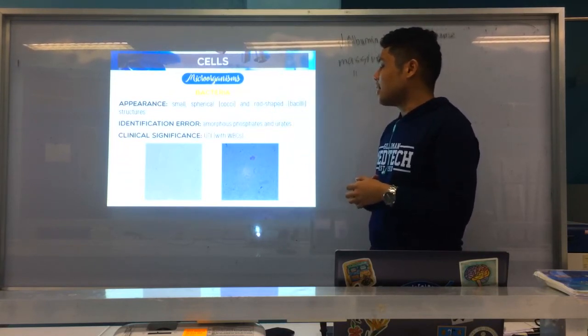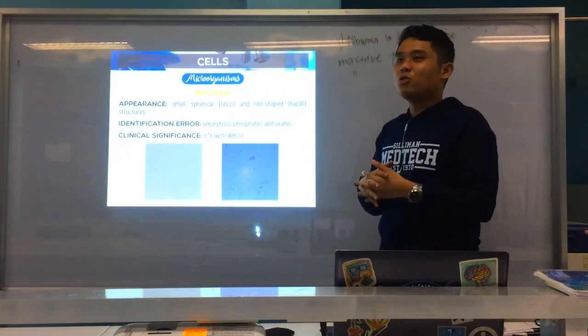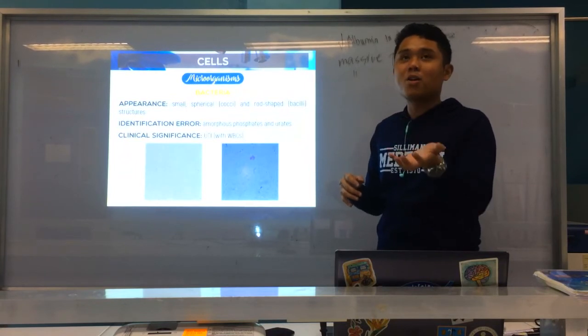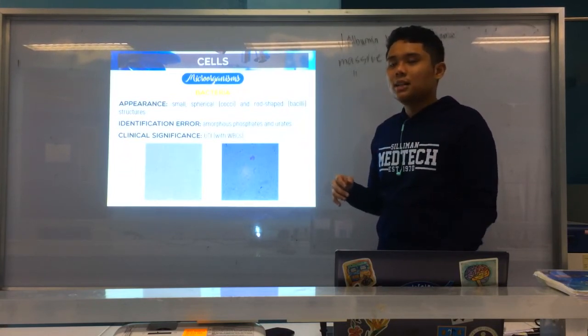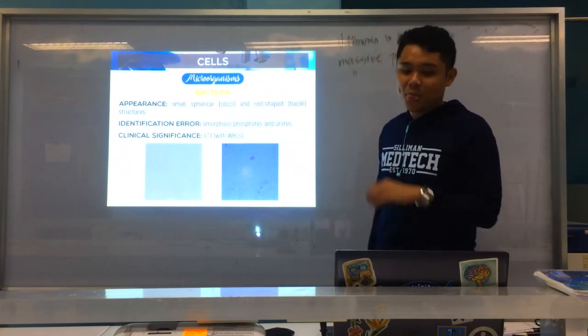Alright. And again, identification error could be amorphous phosphates and urates kay magkumpol-kumpol sila. But usually, in fresh urine, usahay makita nimo na mag-move ang bacteria, through Brownian motion, or if motile ang organism. Okay? Again, significance, UTI with WBCs.